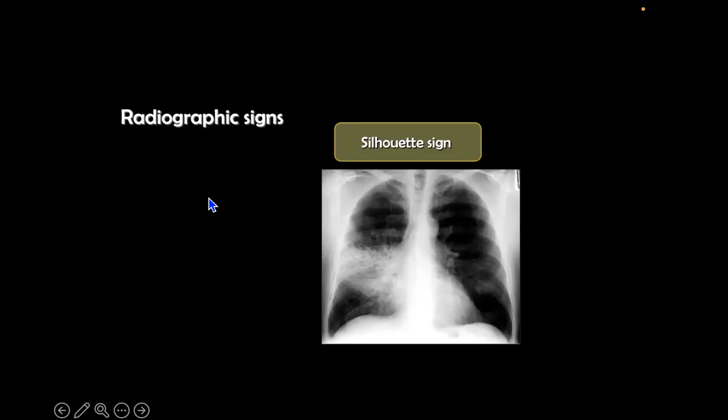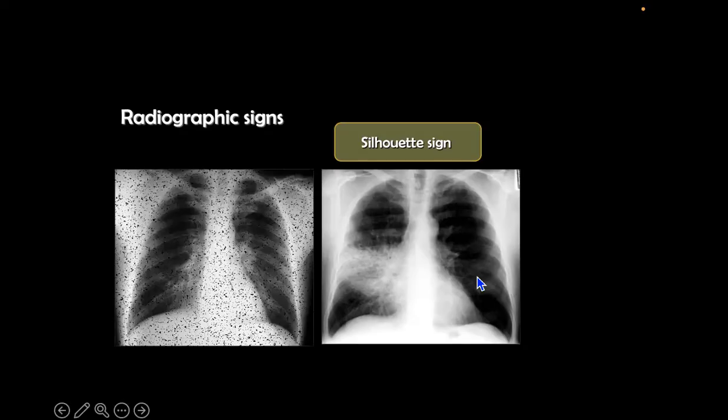So the most important things that we are going to touch are the signs. And I think this is the most important part of the lecture. We have so many signs. When you read a chest radiograph, you have words like consolidation, cavitation, nodules, ground glass opacities, silhouetting sign. All these things, this is the language of radiology. All these signs should be clear to the one who requested the exam and to the one who is treating the patient.